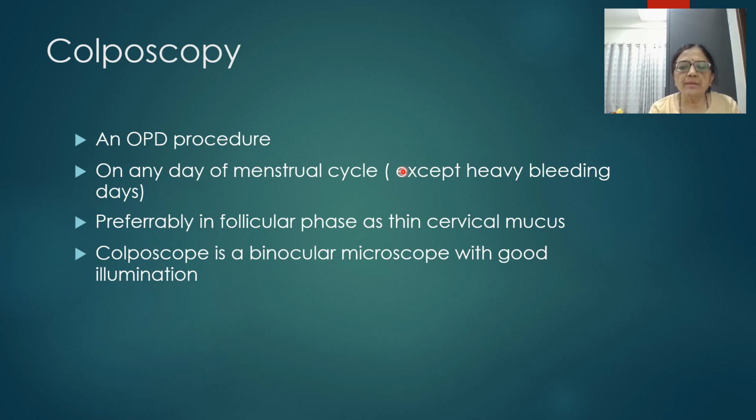So today's class, the main focus will be on colposcopy because it is the mainstay of diagnosis of cervical intraepithelial neoplasia. A word of caution is that colposcopy has tremendous interpersonal variability. The meaning of this sentence is, if the same patient is seen by 2 or 3 different colposcopists, the report will be different with each. It is very, very subjective. And that is why so many efforts in recent years are being taken to make it as objective as possible.